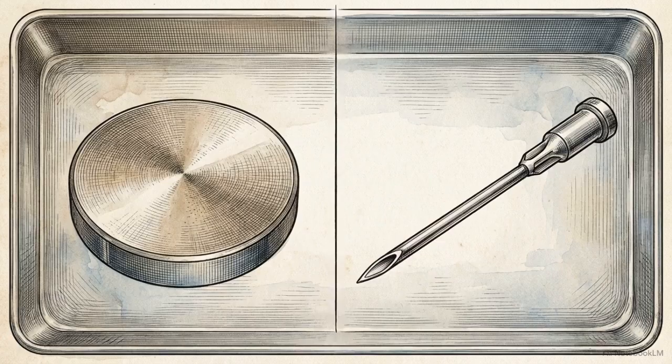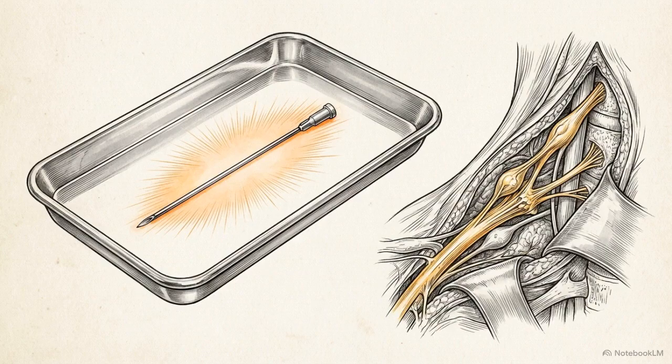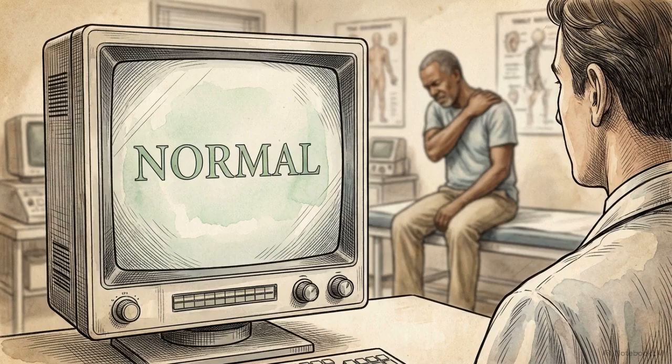The entire diagnostic framework relies on this two-part structure. Nerve conduction studies clear the peripheral mimics, while the needle examination triangulates the damaged root in both space and time. Even with perfect timing and spatial mapping, an electrodiagnostic study only interrogates the motor fibers. If a patient presents with a severe sensory predominant radiculopathy, a completely normal EMG never fully excludes it.